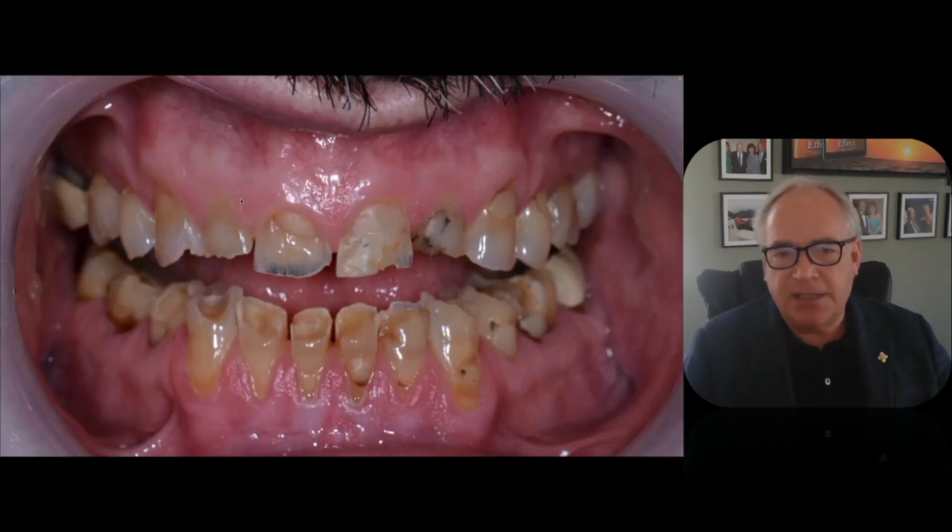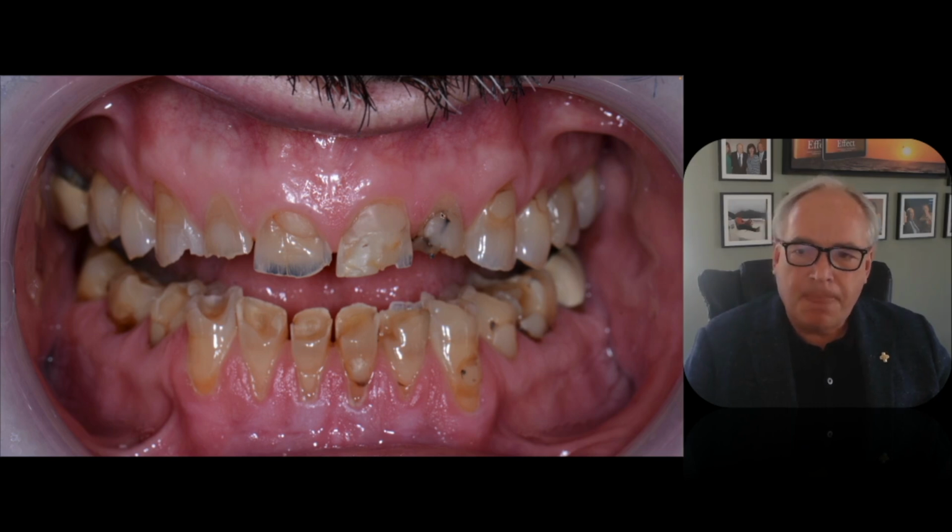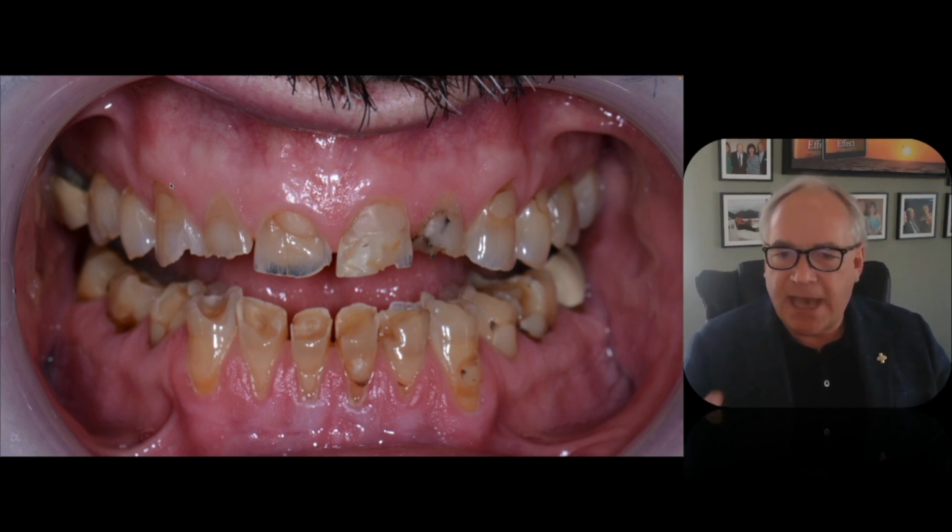We can look at his gingival tissues and see definitely from starting where the height of 6 is that we can definitely come up, bring the laterals and centrals up through crown lengthening to expose more tooth and to give us that ability to grab on for some ferrule effect. So the combination of crown lengthening and building up and opening the vertical so we're not cutting any away gives us a lot of help.